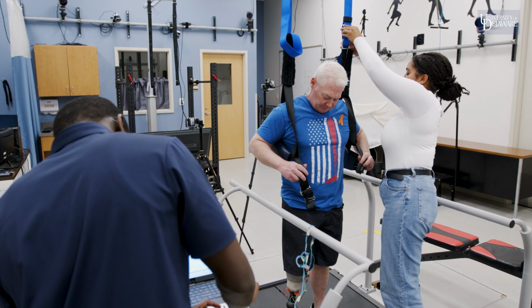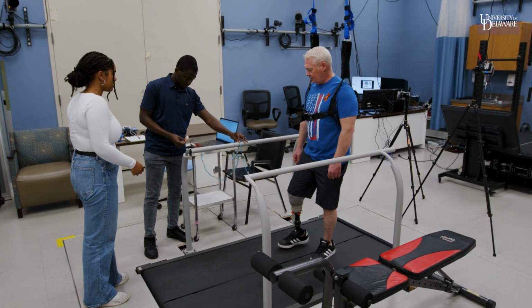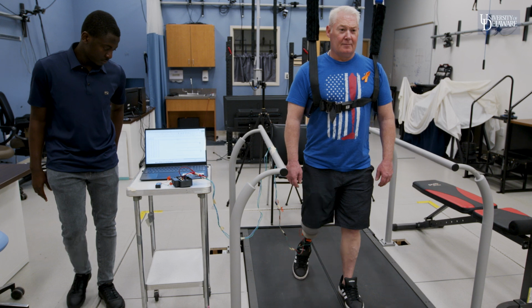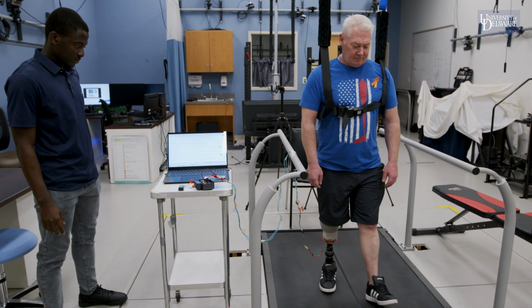We want to monitor limb loads in especially individuals with lower limb amputation to determine whether they're being loaded symmetrically, whether they're overloading over time, and also to make sure that they're using their limb optimally. We think that this is also going to provide a really useful tool when someone's learning to use a new prosthesis or trying a new activity with time, like starting to run on your prosthesis, to monitor how well you're loading, again, whether you're loading symmetrically. This would be able to provide validation for insurance purposes, showing that people are using their prosthetic.